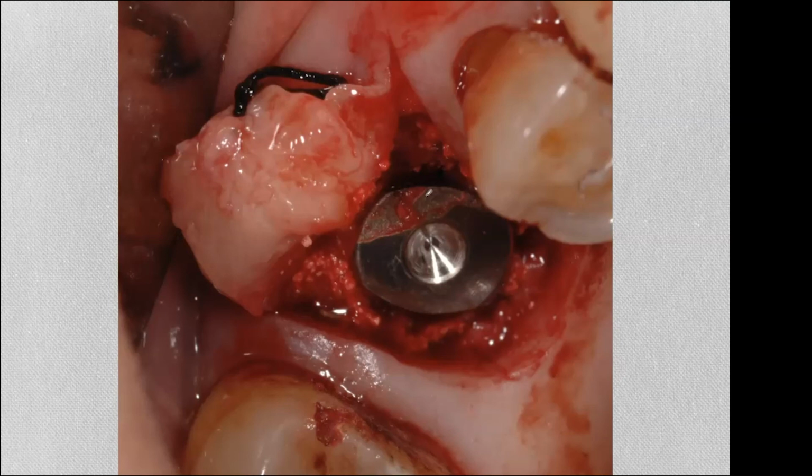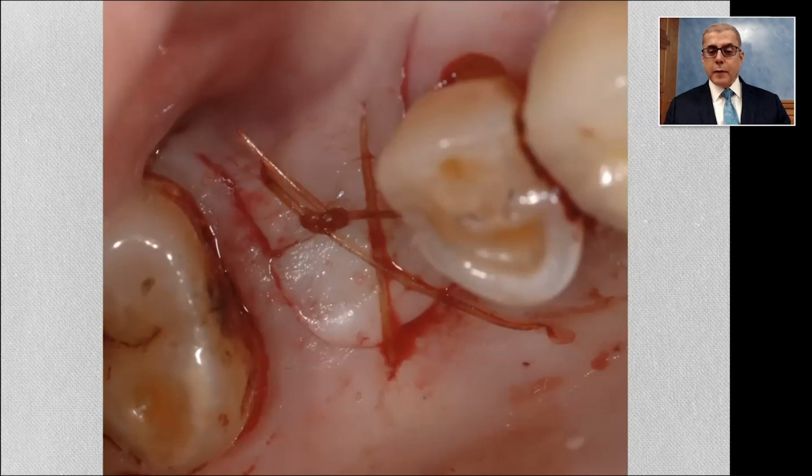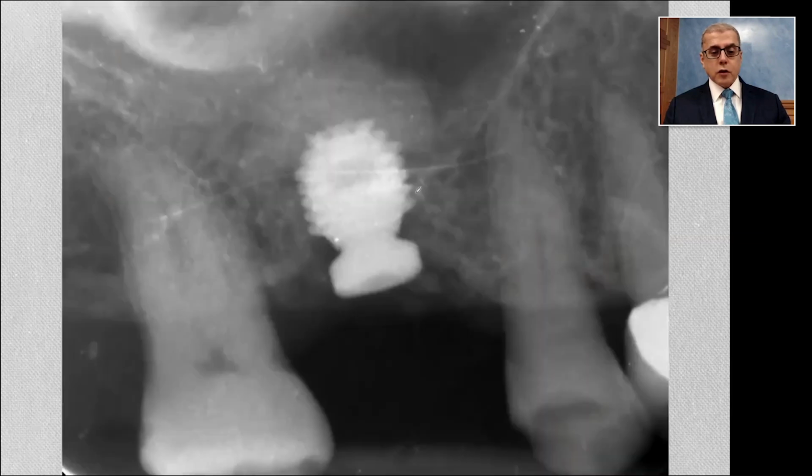the implant until the top of the sinus lift abutment is flush with the crest, so that we can close, we can suture, and it's flat. And that's the sign that we did our job, and the implant is flush with the crest. So as we can see here, only about one plateau is contacting the native bone. And in this case, you can make a case, well, maybe I got more. So we probably got more stability.